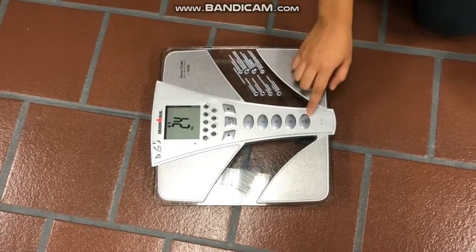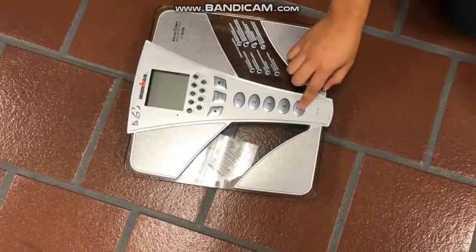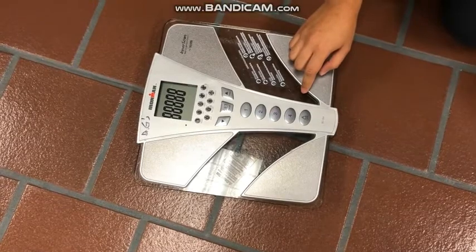Once the settings are complete, the participant will step onto the scale, and their body composition will be measured.